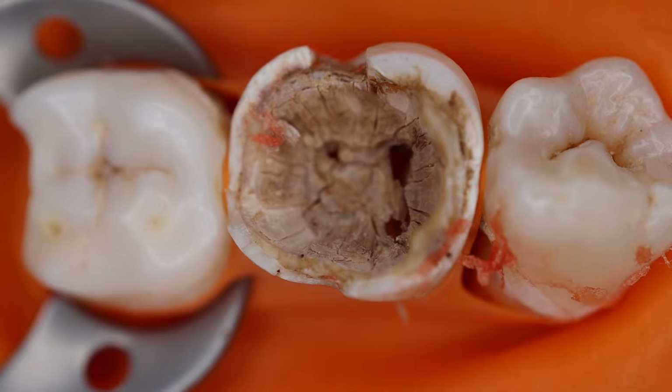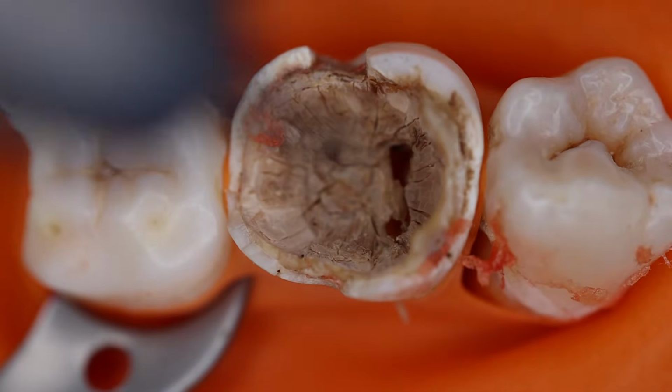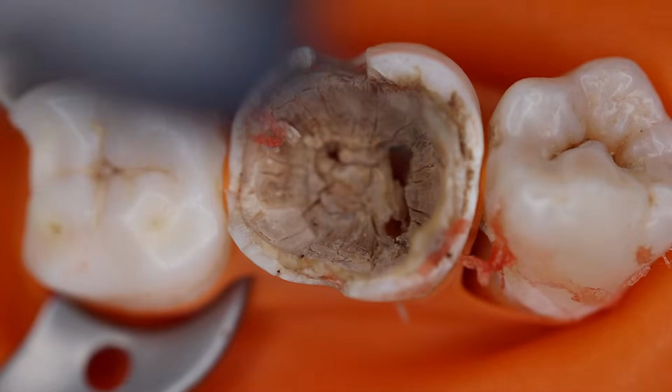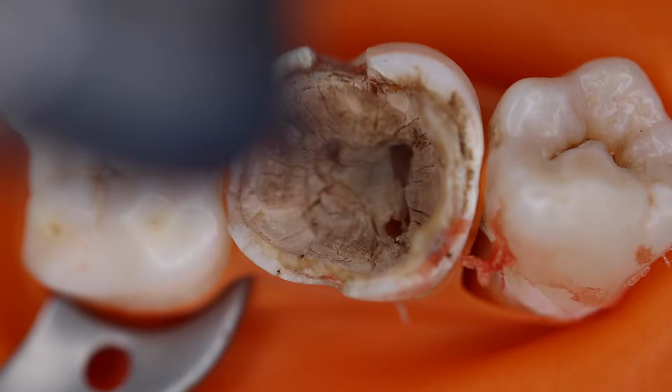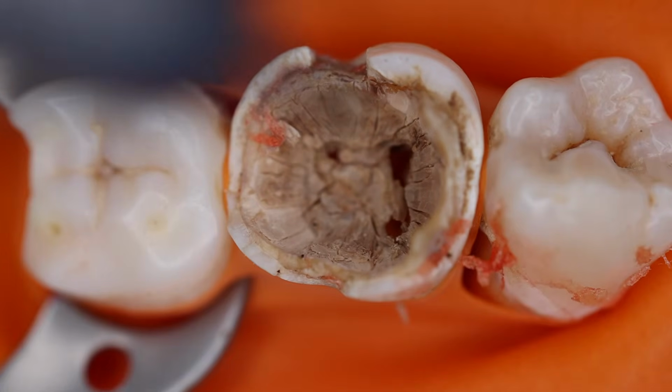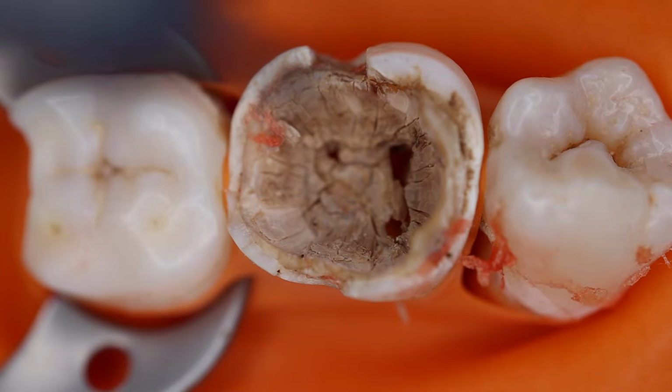So in this session we are going to go step by step and learn what the crucial things are that we need to do. We have a running poll ongoing about the crucial steps during the access cavity preparation of such molars: what is the most important thing amongst all? You should be able to understand and pick from those options whatever you feel.